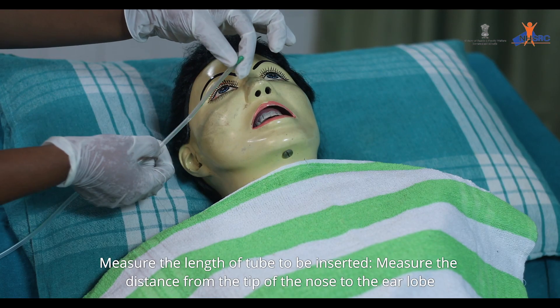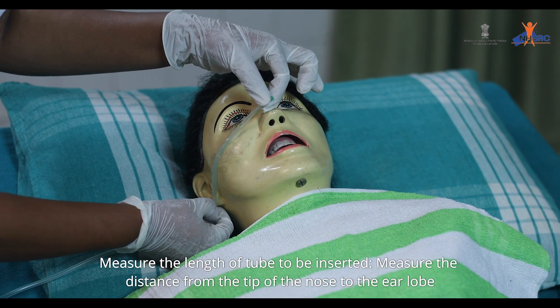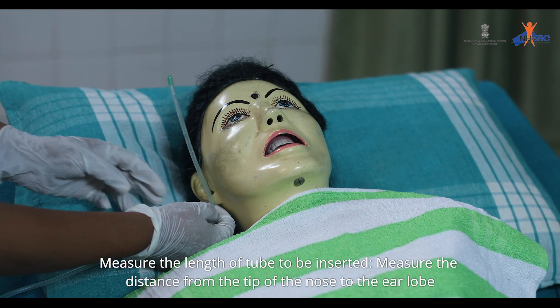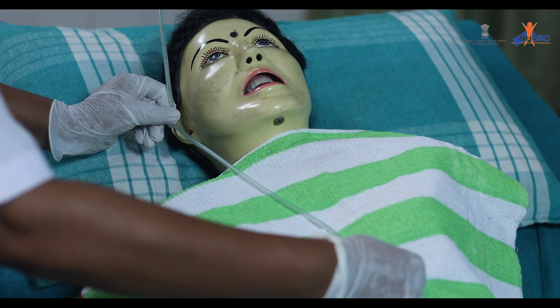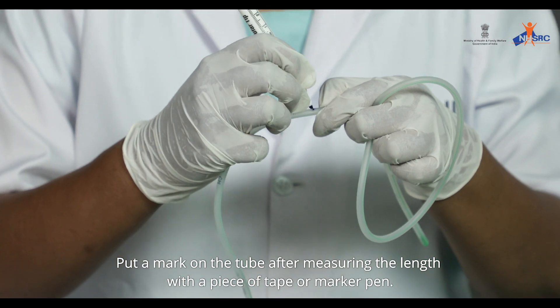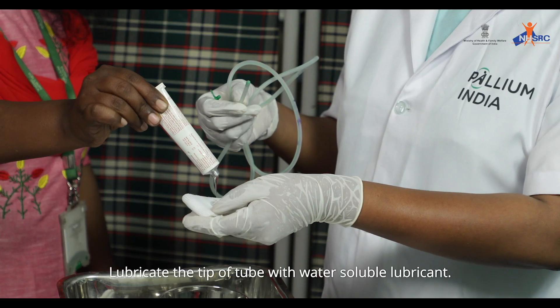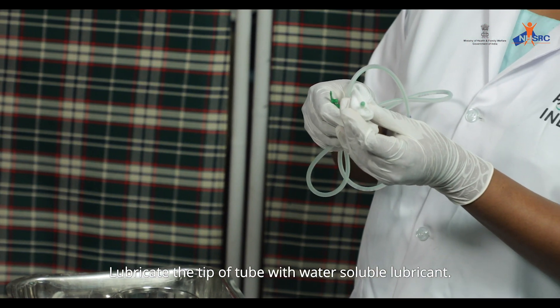Measure the length of the tube to be inserted: from the tip of the nose to the ear lobe, and from the ear lobe to the xiphoid process. Put a mark on the tube using tape or a marker pen. Lubricate the tip of the tube with water-soluble lubricant.